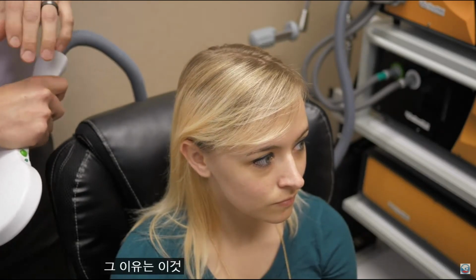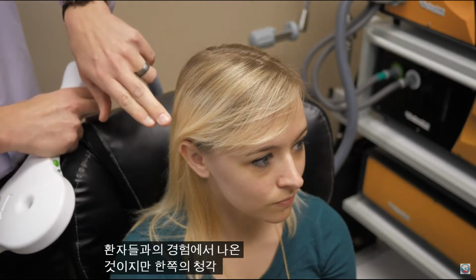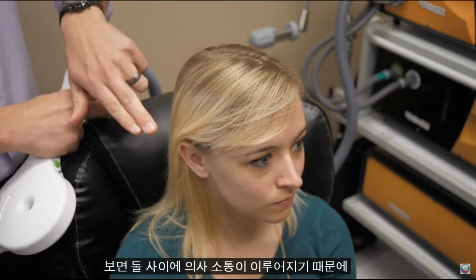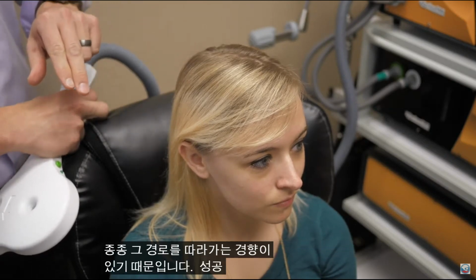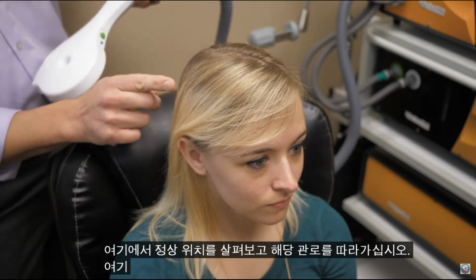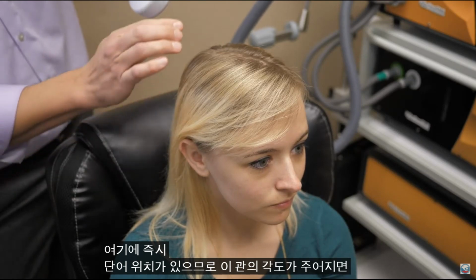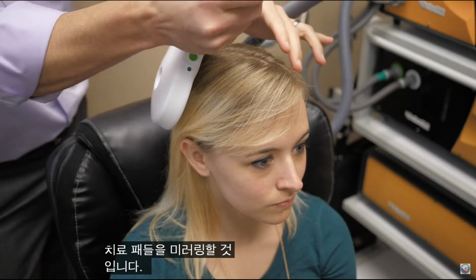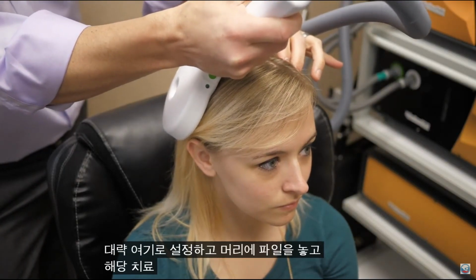The reason why is that this has just been from experience with patients, but when you look at the auditory cortex on one side, there's a communication that runs between the two. So because of that, often following that tract tends to be another successful treatment area. And so with that in mind, we'll take a look at the normal positioning here, kind of follow that tract up, and here medially is where it plays. So given the angle of this tract, I would also mirror the treatment paddle for that location. So I would then set it approximately here, laying flat on the head, and then deliver that treatment.